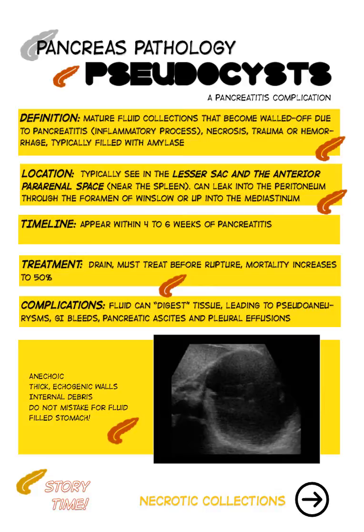When you think pancreatitis, one of your first thoughts should be a pseudocyst. The two just really go together. So we want to make sure that we understand what pseudocysts are and how to identify them on ultrasound.